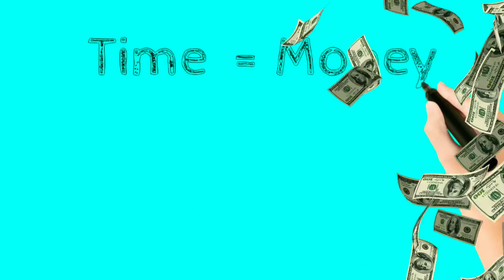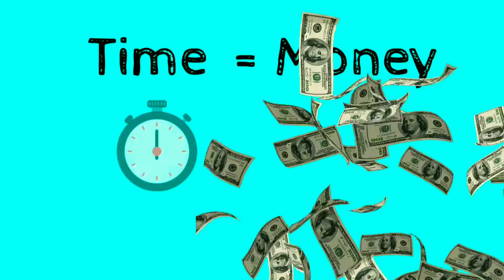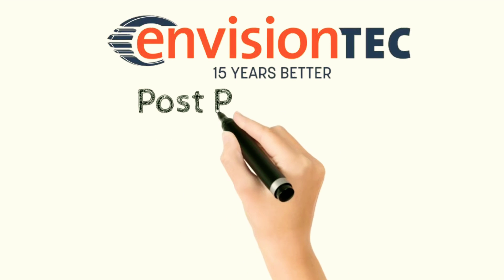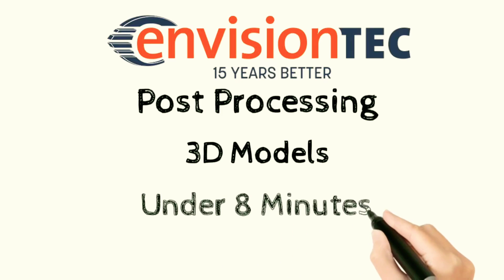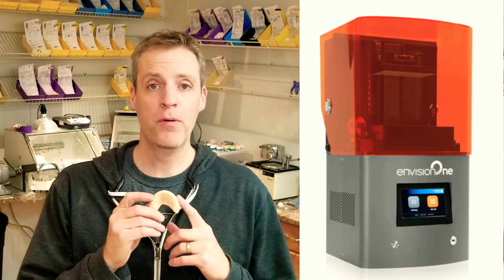Time equals money. Post-processing 3D models under eight minutes. Steve Zara here from Zara Dental Lab, and in this lab video I'm going to demonstrate how I post-process and cure my Envision 1 models.